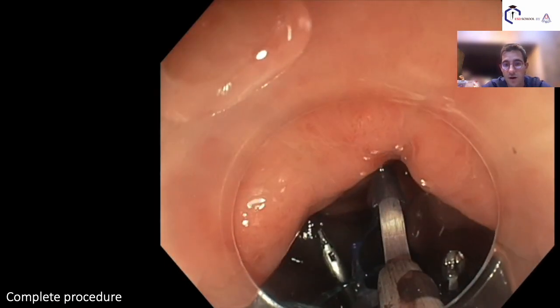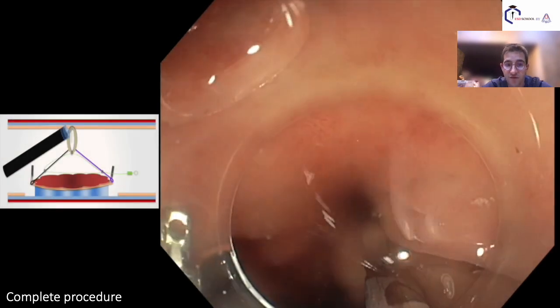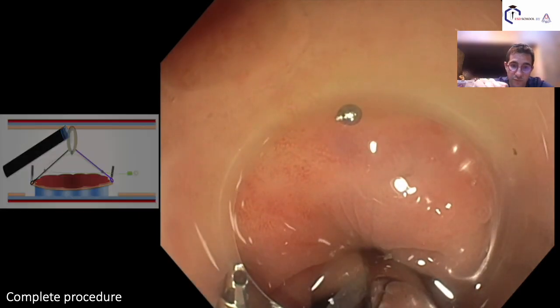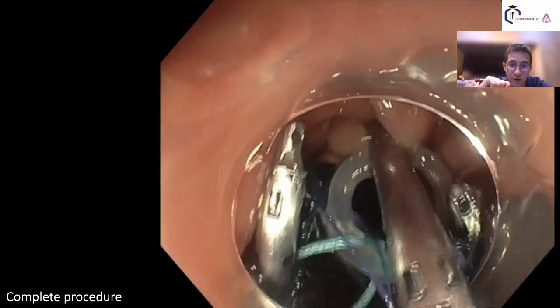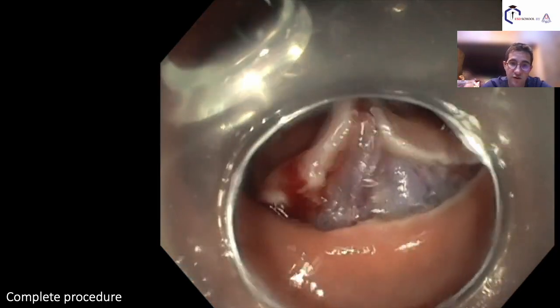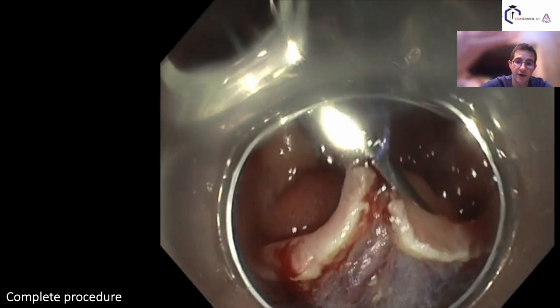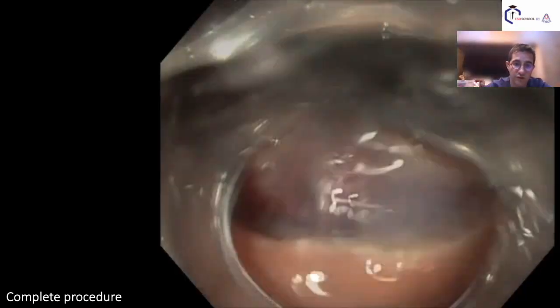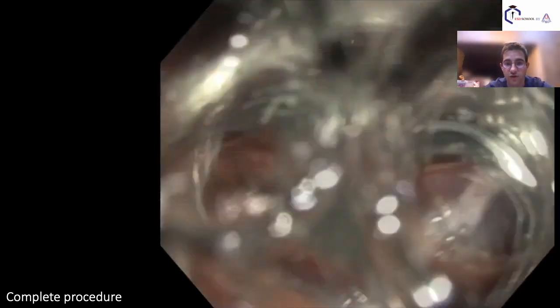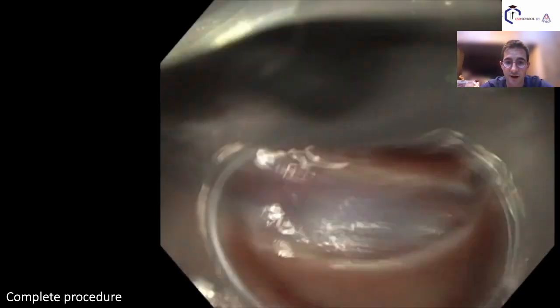So now we catch the rubber band, go to the opposite side, deflate as much as possible in order to create a fold, and if it's not enough, we will catch again, but here it was okay, and you can see the exposition. By inflating the colon, you really create a triangulation with a left end that stretches the mucosa and that stretches all the points of the lesion, the 4 cardinal points. So ESD will begin now.